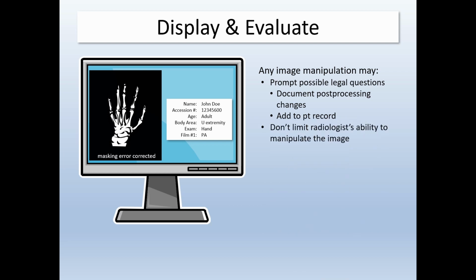Additionally, if you adjust the window width or level, return the image to its default settings before posting to the PAC system. Some systems will not allow further window width or level manipulation once posted to PACs if changed from the default settings.